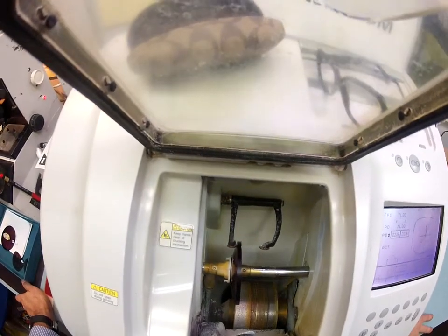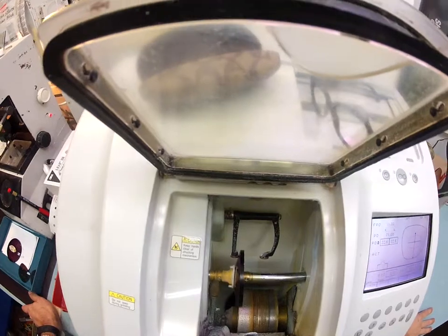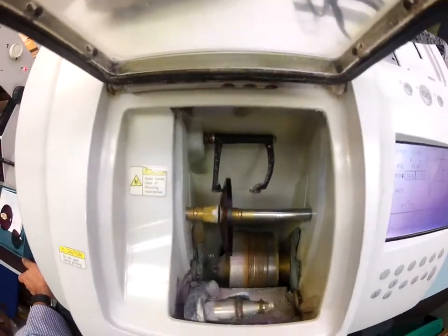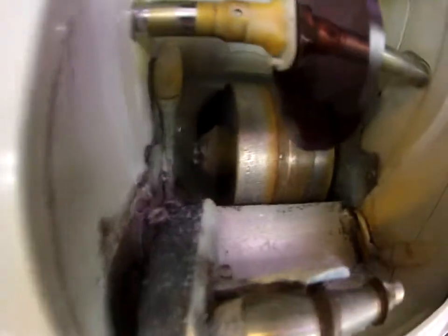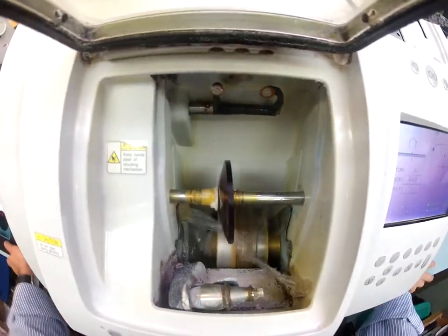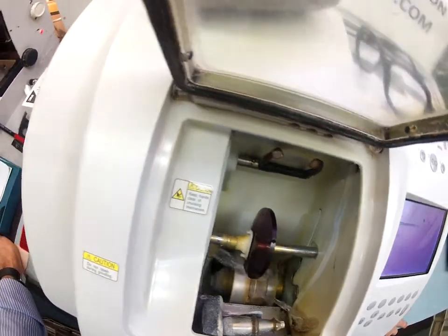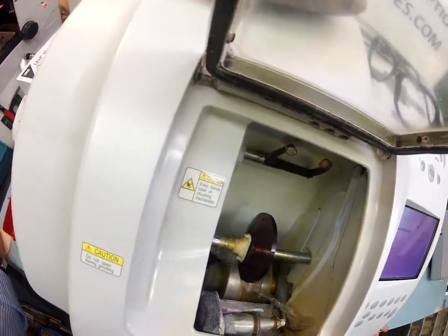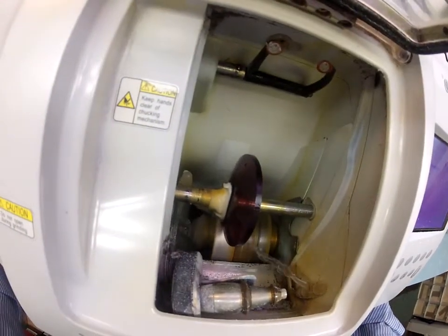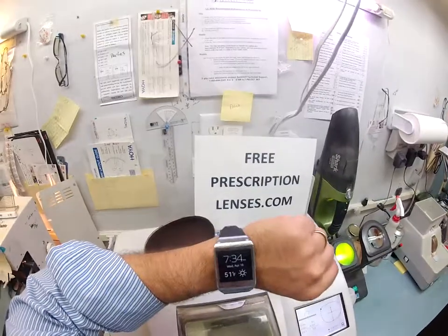Now it's tracing the convex side, which is away from your face, using the calipers to measure the thickness of the lens to know exactly where to put the bevel. The actual cutting wheel is down here on the left. The lighter color wheel is like a heavy grit sandpaper. That's going to grind away most of your lens, and then this wheel in the center is what's going to put the bevel onto the lens so it stays inside the bevel of the frame. I will have to close the door in a moment, but I want you to see your prescription lens as it touches the cutting wheel. This whole process is going to take about 15 minutes.